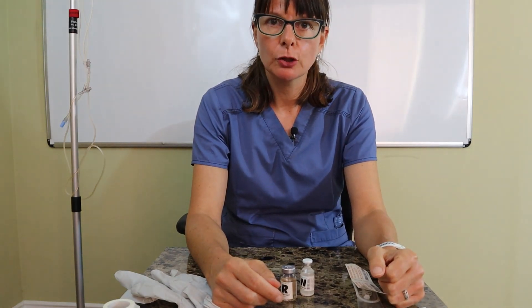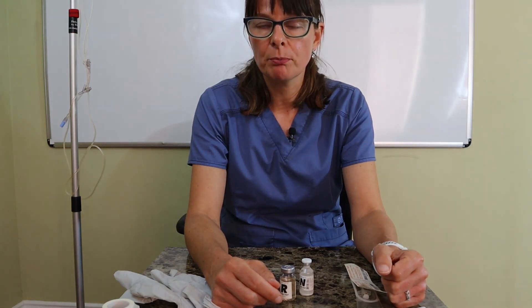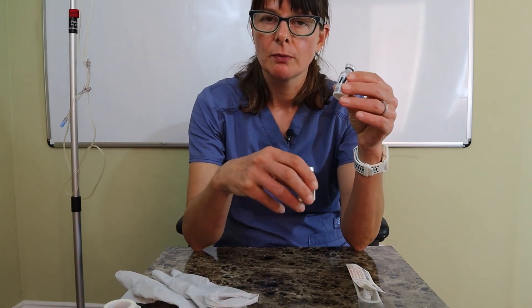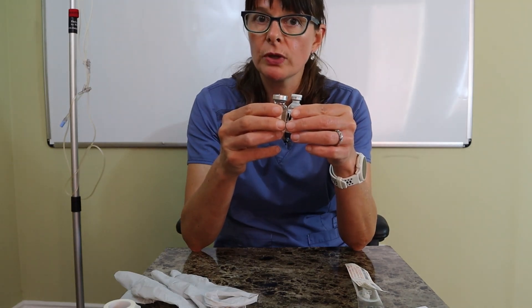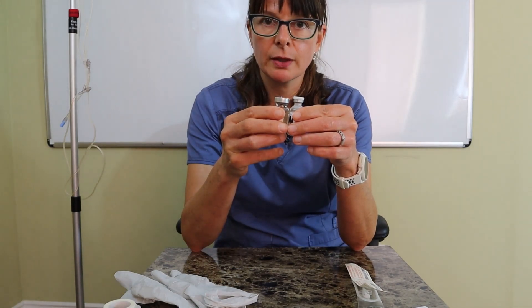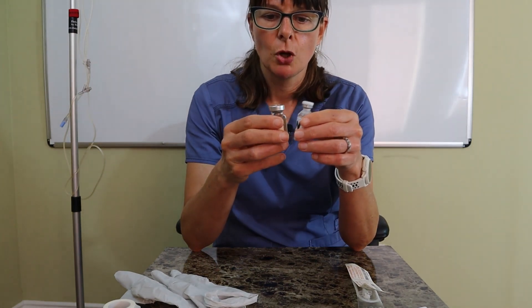Welcome to nursing school explained. In this video on mixing insulins, the two insulins we can mix in one insulin syringe are regular insulin and NPH. Because the two insulins have different onset, peak, and duration, we have to be very careful not to contaminate one insulin and inadvertently put it in the other. That could adversely affect the patient, so we always need to double-check the correct dosages and use the proper technique.